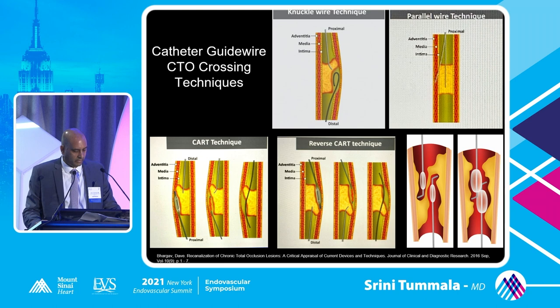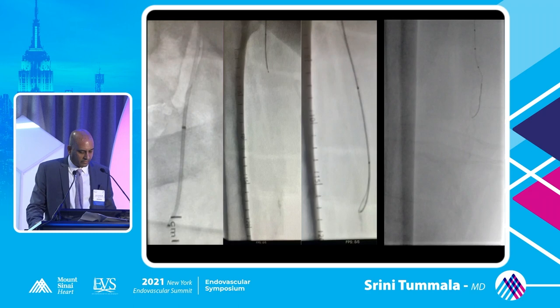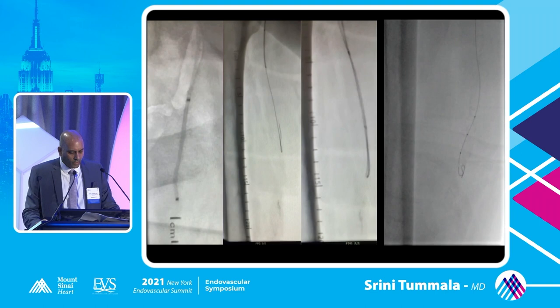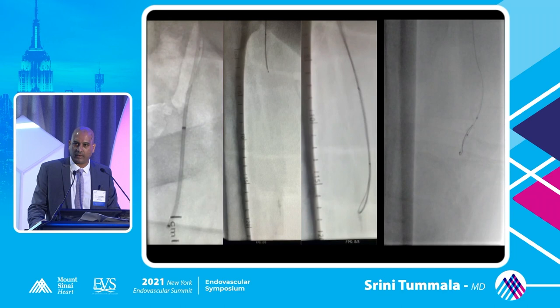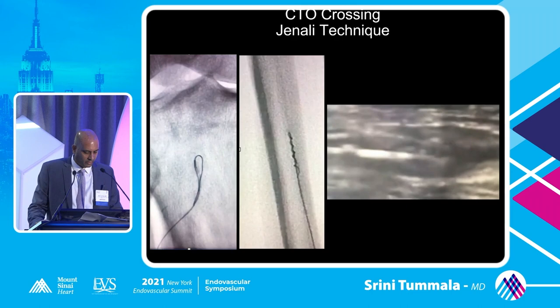For anyone who has crossed a CTO, there are various techniques shown here. On the far left is a 4 French Navi cross catheter using the classic Navi bossing technique — pushing and rotating the catheter. In the middle is a knuckle wire technique. On the far right is a classic sub-intimal recanalization with a CTO catheter and a Command 18 guide wire — you can see the guide wire and catheter spiraling around the vessel, clearly in the sub-adventitial space.